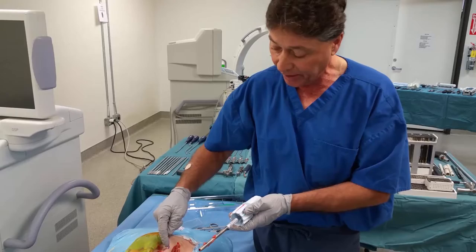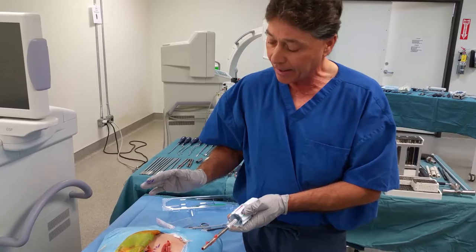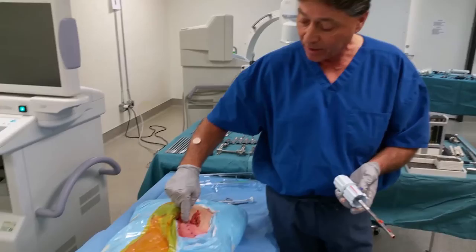Typically, I will then irrigate this a little, take a little gel foam with Marcaine, place it in the defect, and close the wound. And the typical response of the patient is either zero pain or trivial pain for the first week, week and a half. That's it.